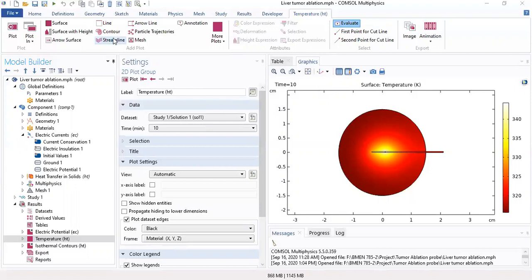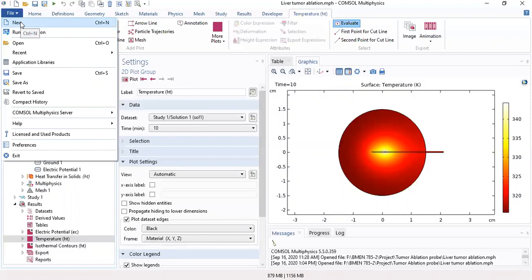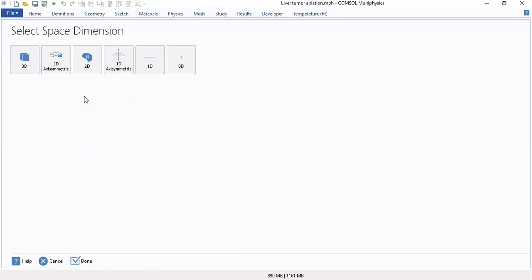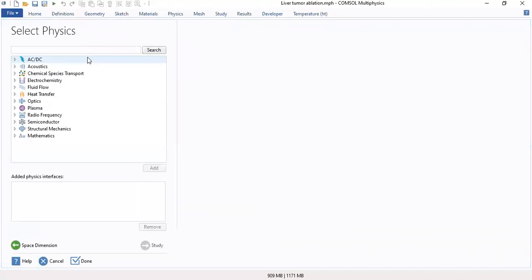So let's get started. Open a new COMSOL file. And what we're going to do is open the model wizard. You can also do it from a blank model, but you have the model wizard, that's the easiest way, so might as well use it. You're going to use this 2D, the one with the pie in it.